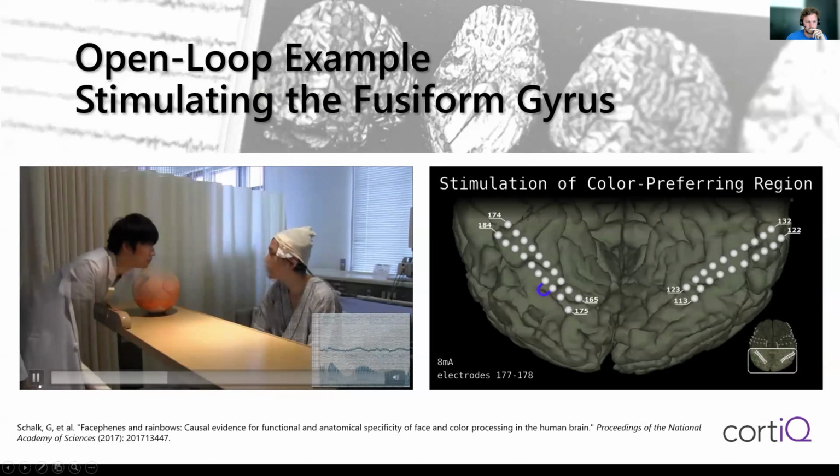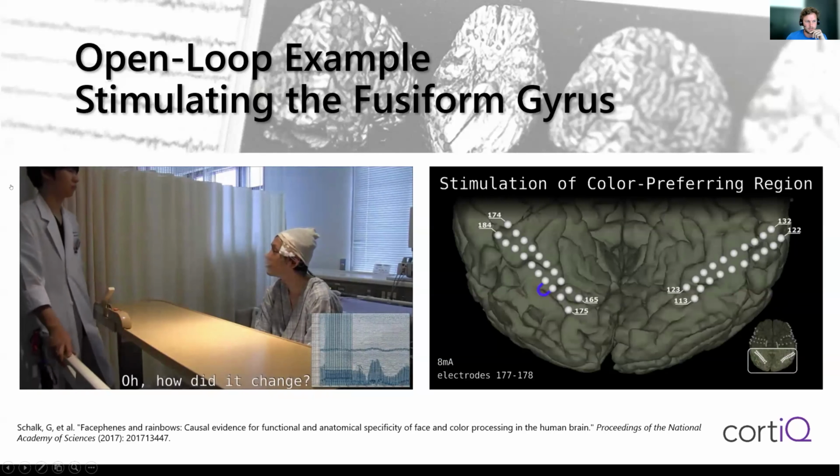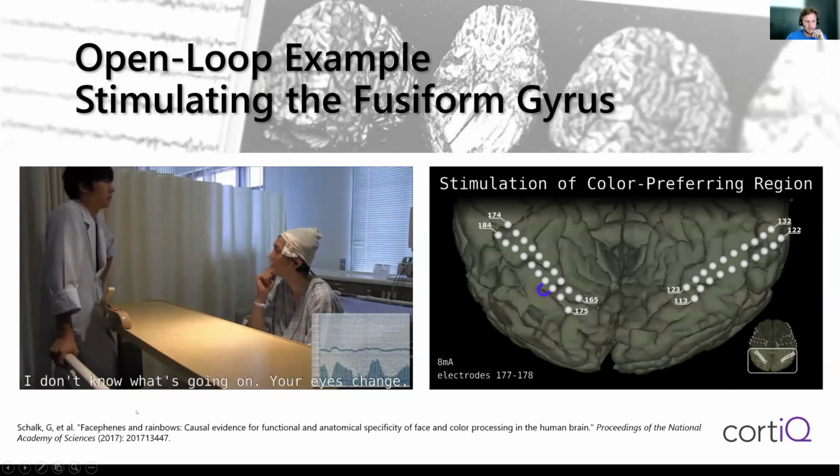And here, looking at the neurosurgeon Dr. Ogawa, the face completely changed during stimulation.